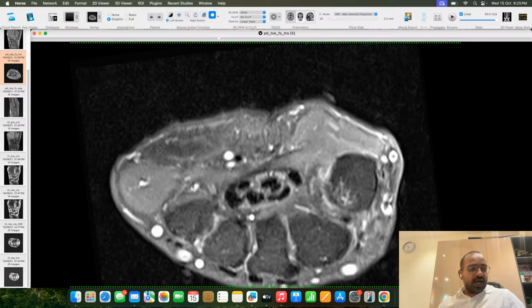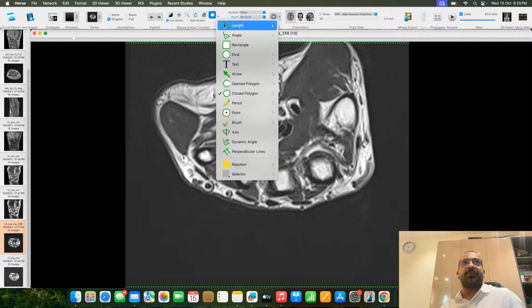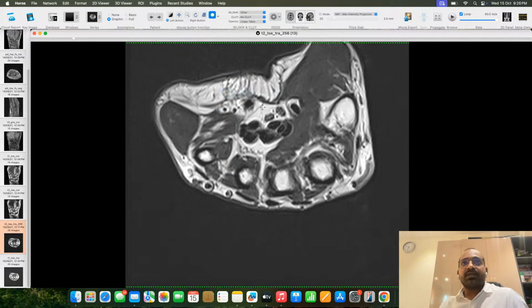I have measured something; I have made some calculations. I took the entire thing. But if it is a bifid median nerve, should I take the entire circumference like how I took previously? For measuring the area, should I take it like this, or how should I do it? Should I measure this entirely or take it separately?